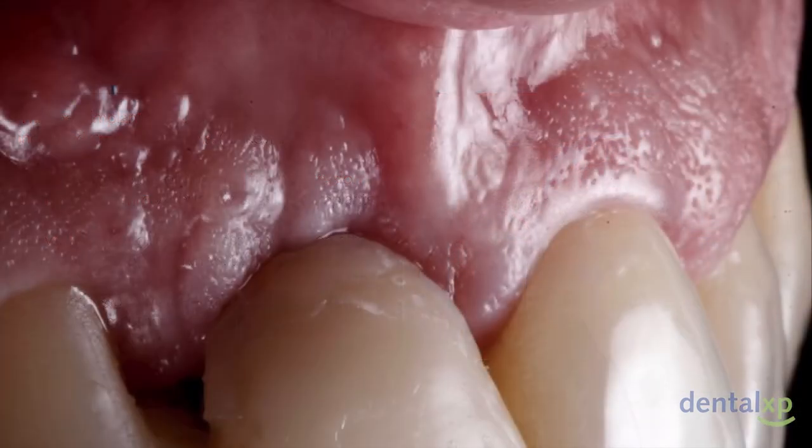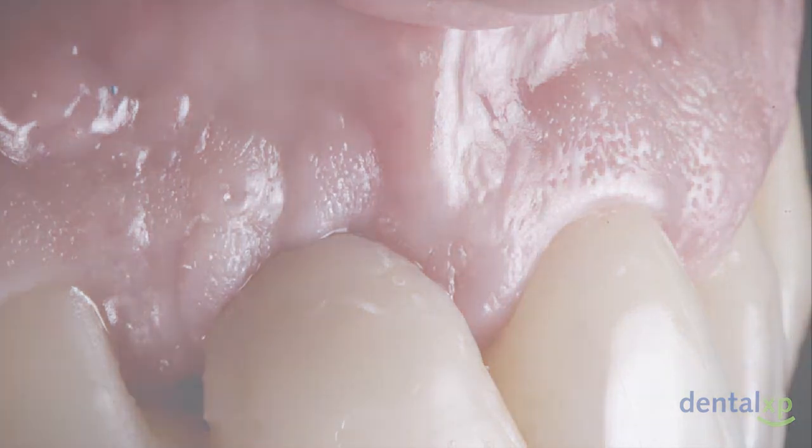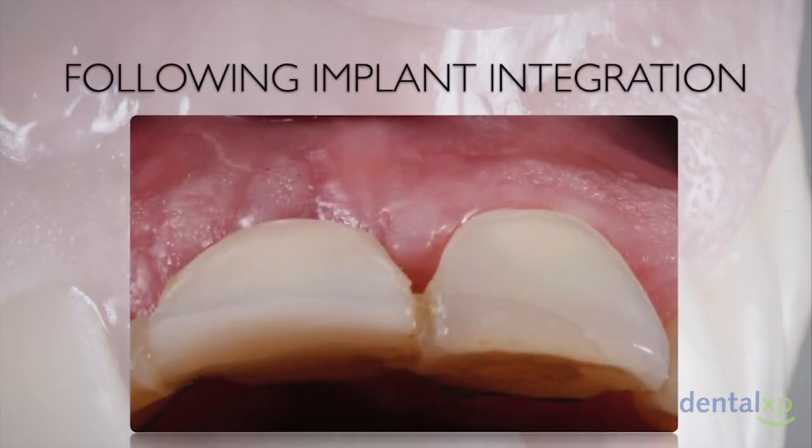So when can we perform our soft tissue augmentations? One of the options is, in this case, following implant integration. So the implant was placed and this is the time of second stage uncovering, and you could see that we have a buccal soft tissue deficiency in the site of the upper right central.